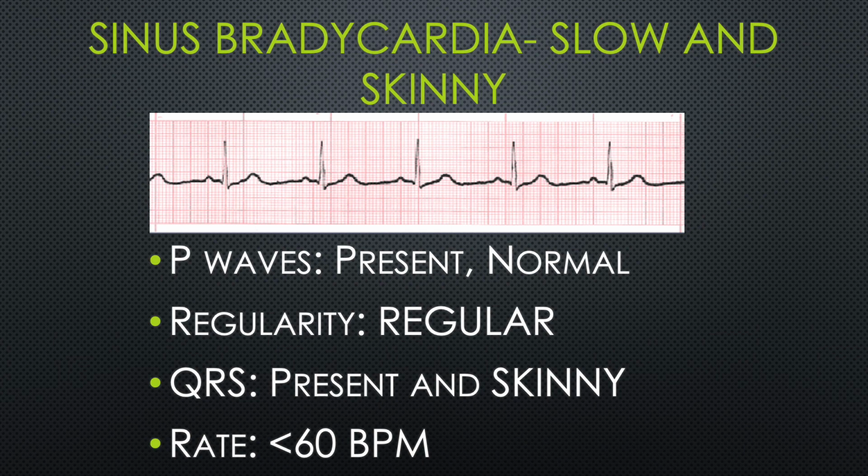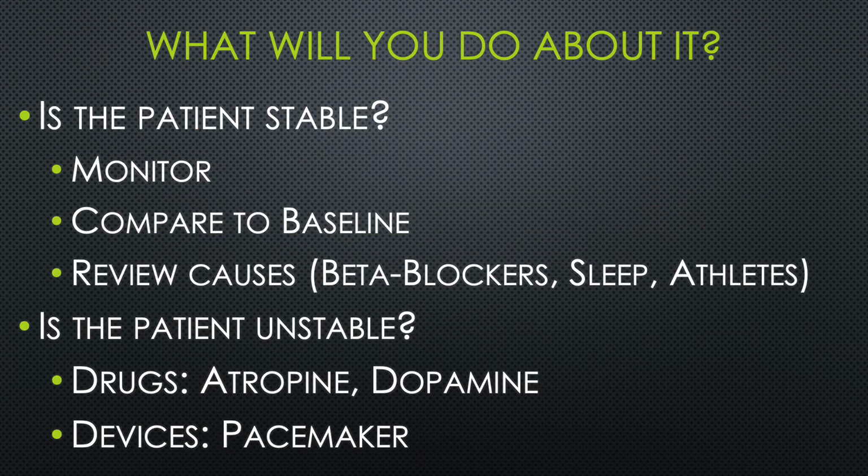But look over here. What's different about this rhythm? It's the rate. So everything about this rhythm is normal except the rate. So it's normal, but just a little slow. So the rate's going to be less than 60 beats per minute.